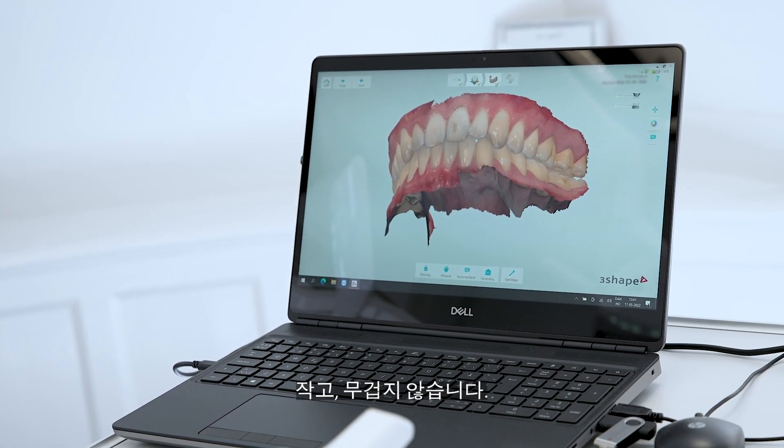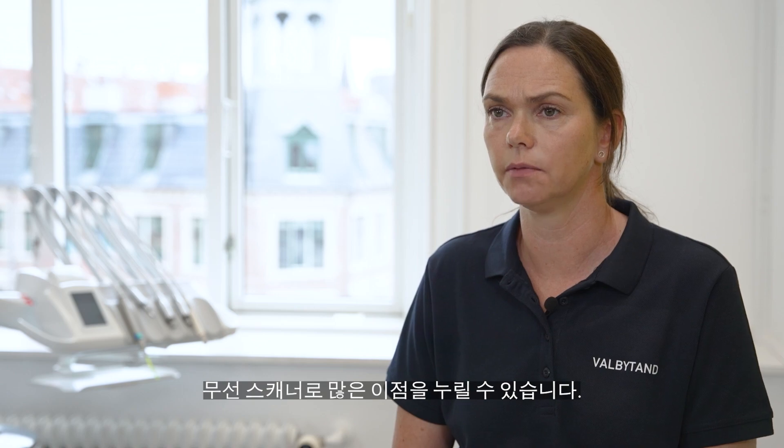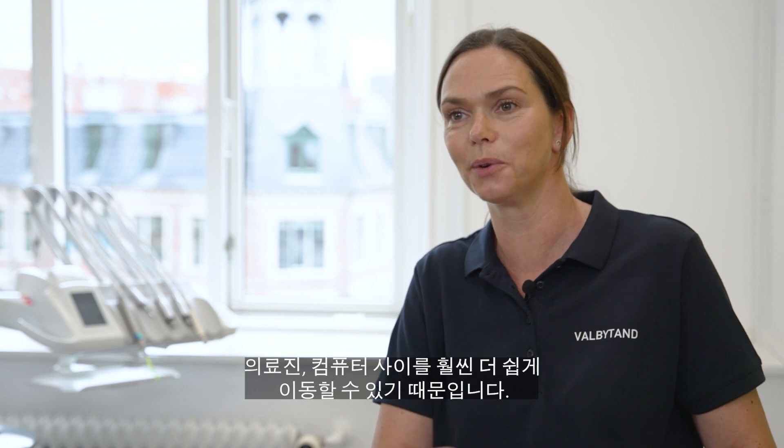It's light, it's not heavy. You can hold it like you're holding your normal dental instrument. A lot of advantages with having a wireless scanner, because it's so much easier to move around — around the patient, around yourself, around the computer.